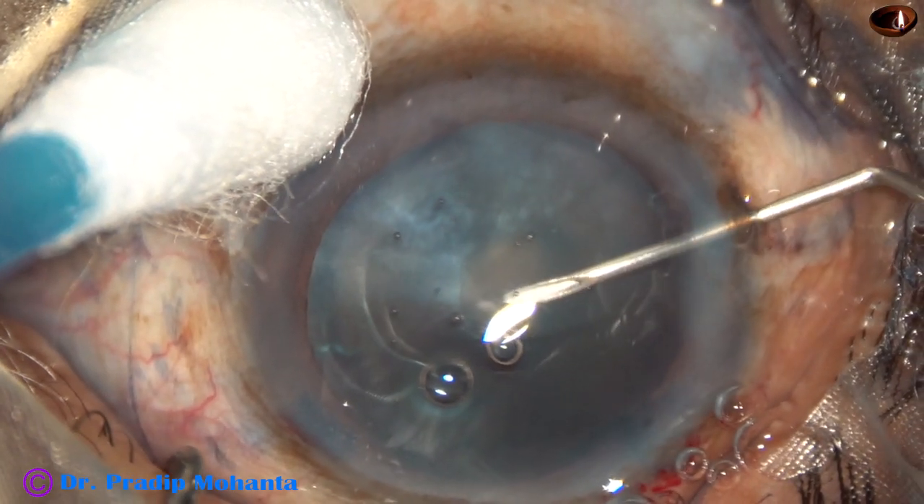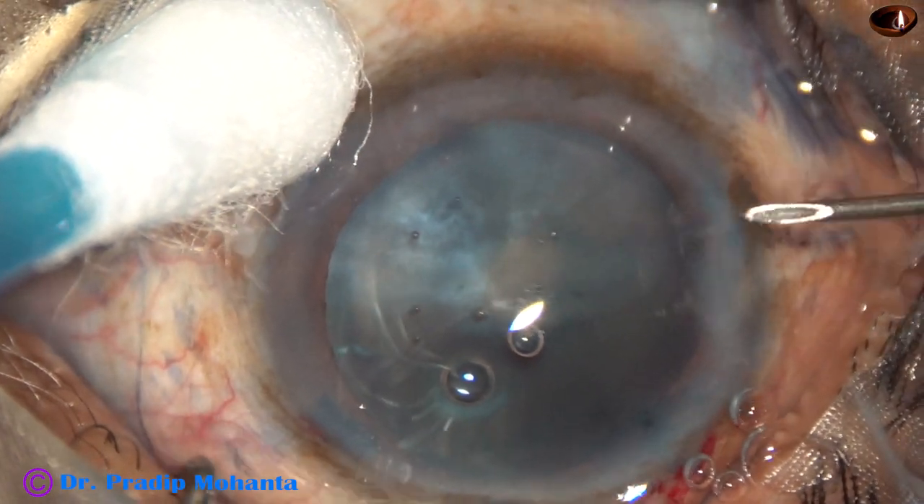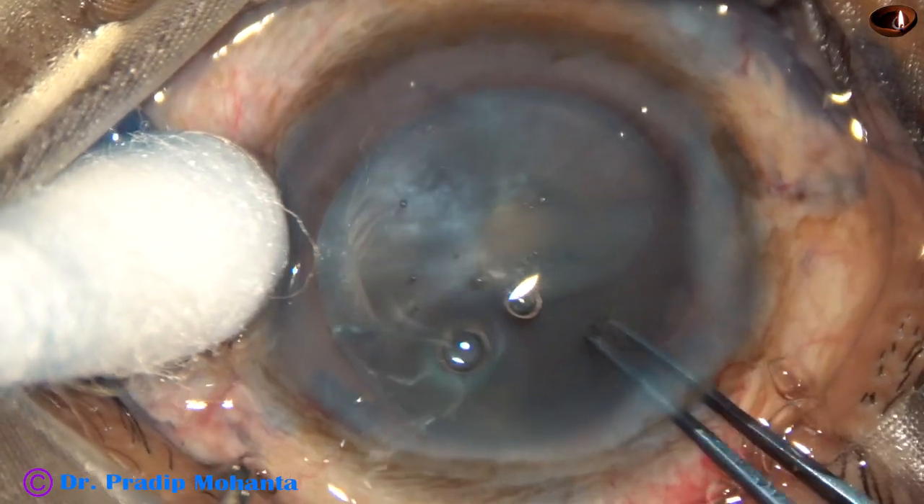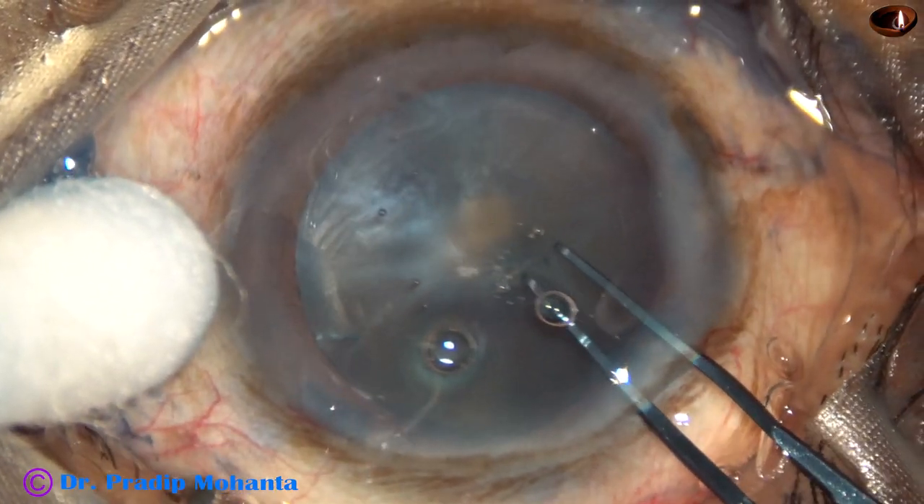As soon as the anterior capsule has been incised, some oily fluid has come out. Immediately I decide to do a small rhexis.